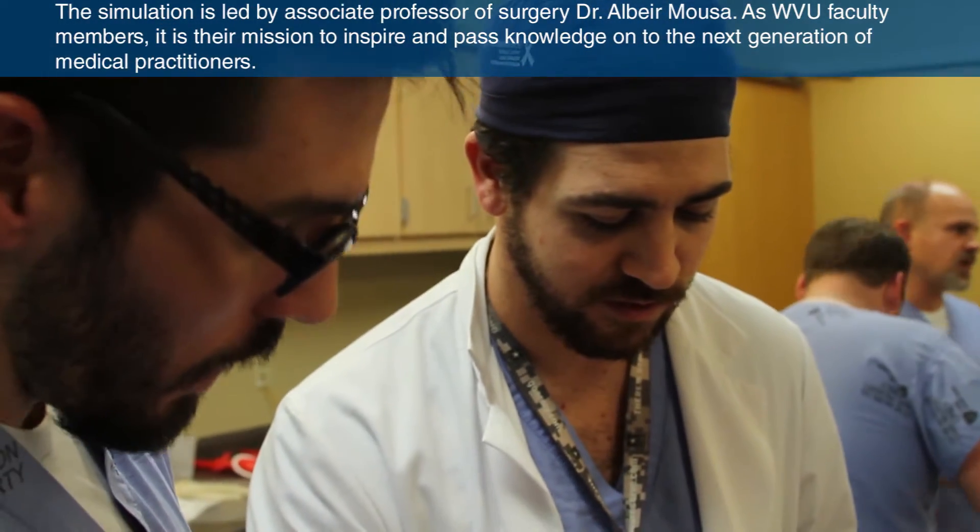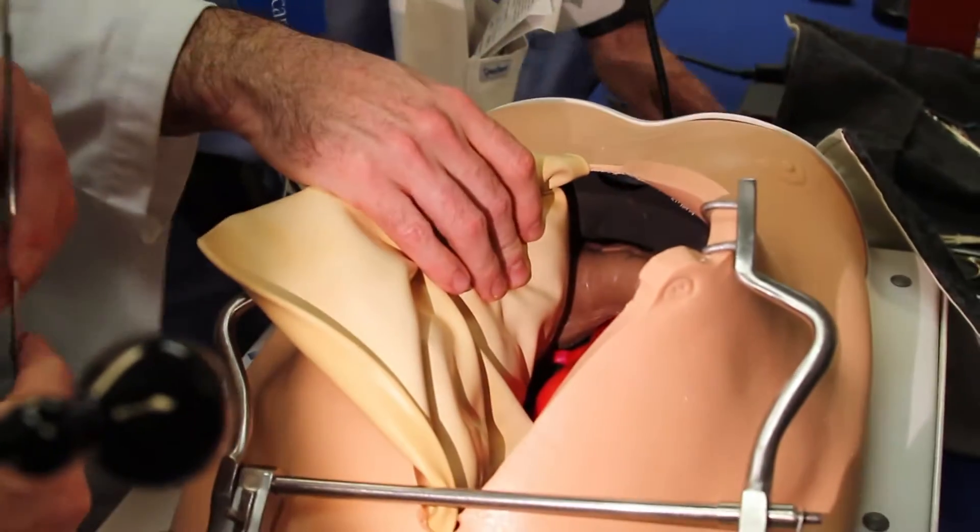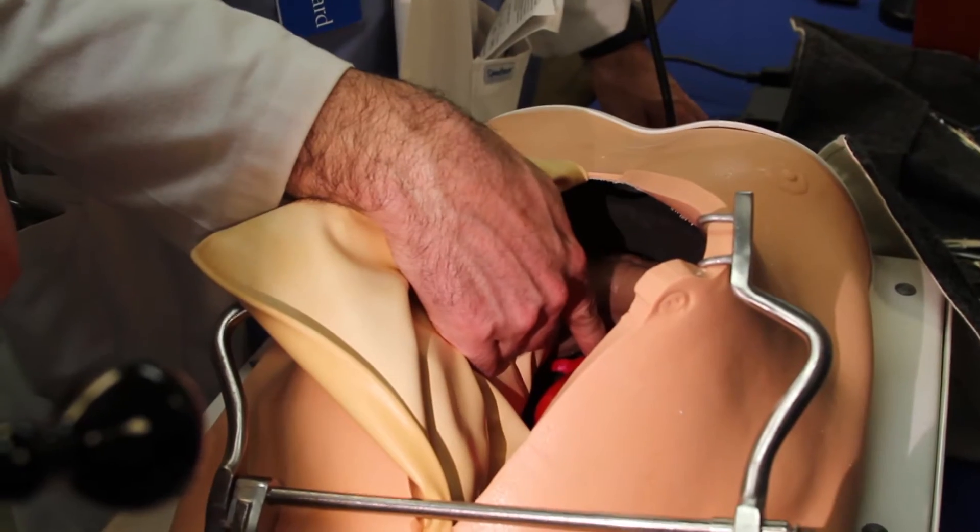What's crossing over here? The left renal vein. Remember — that's going to be basically your superior landmark, about 95% of the time.